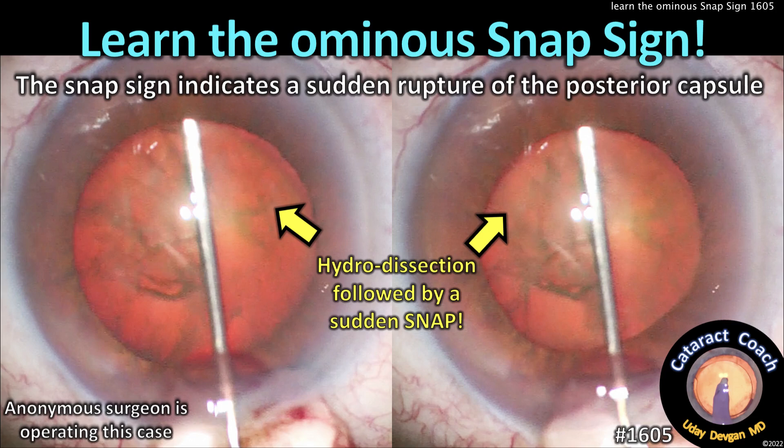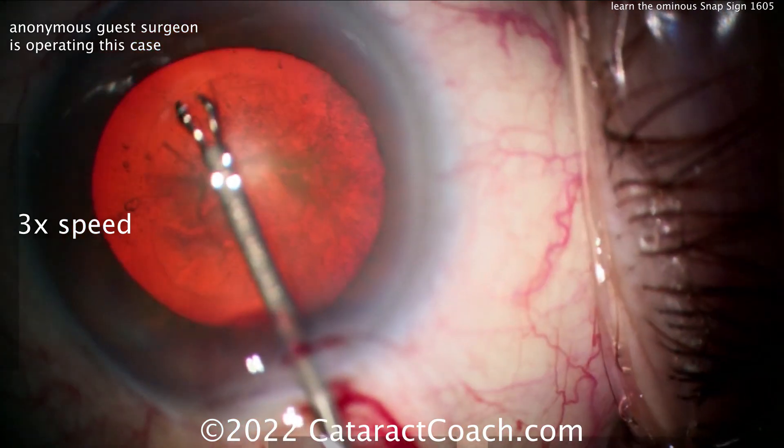CataractCoach.com — you must learn the ominous snap sign. The snap sign indicates a sudden rupture of the posterior capsule.